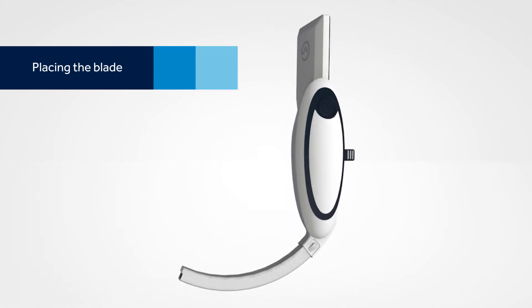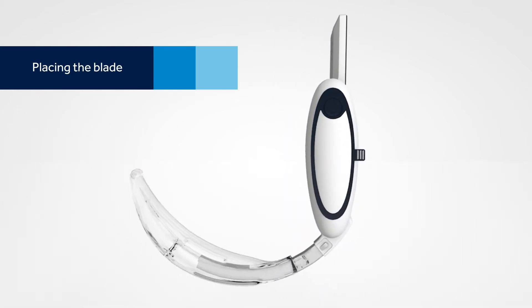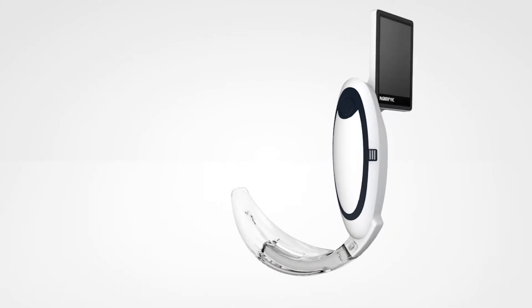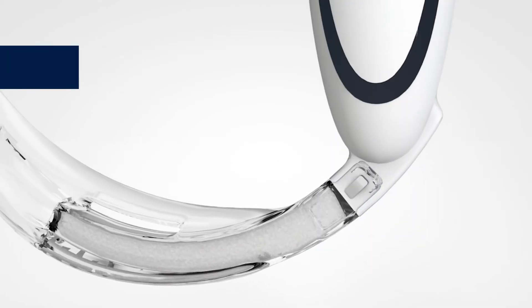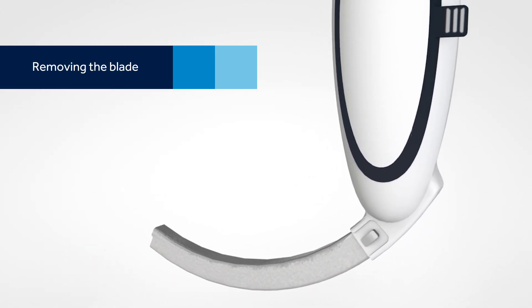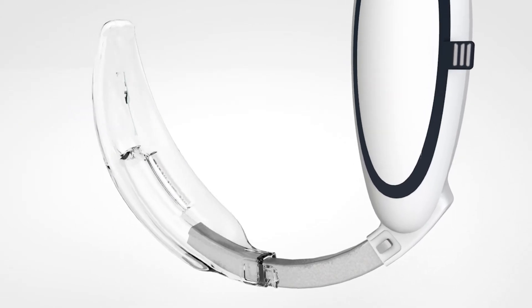For the next step, remove a blade from the sterile packaging and slide it over the camera stick. Make sure the blade locks into place with the tab on the camera stick. To remove the one-time use blade, lift up on the tab to the left of the camera stick and slide the blade off. Then properly dispose of the blade.